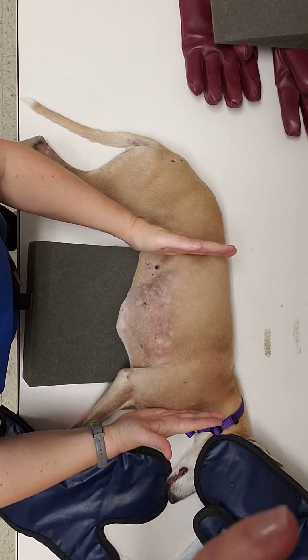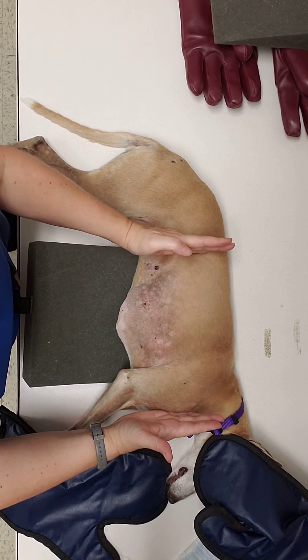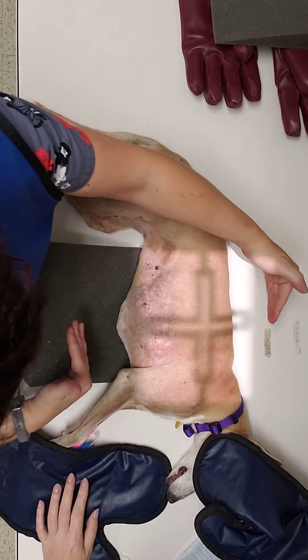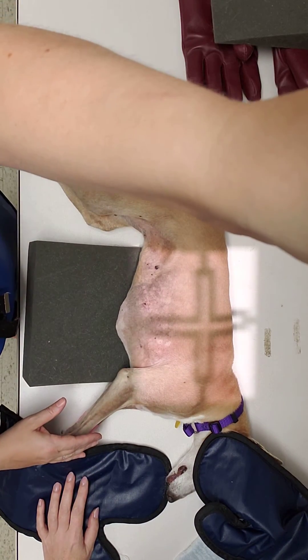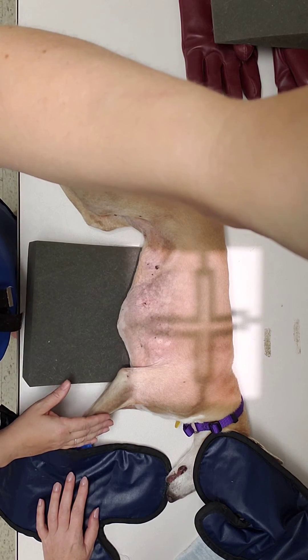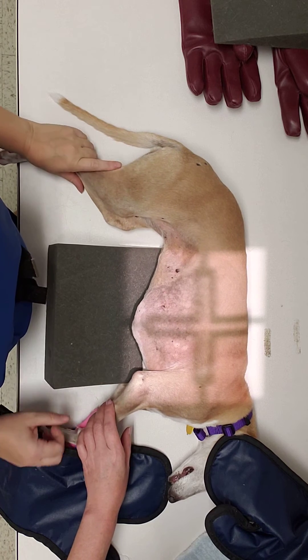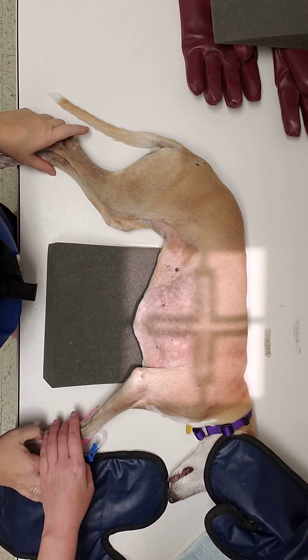You also want to make sure that you're equal with the last rib — in her case you can feel it, the caudal aspect is right here. You want an inch on either side of your patient, so I'm going to make that a little bit wider and shift her back just a little bit.